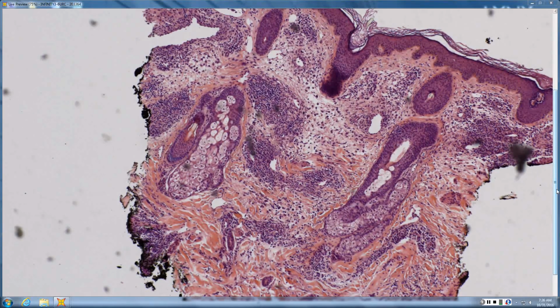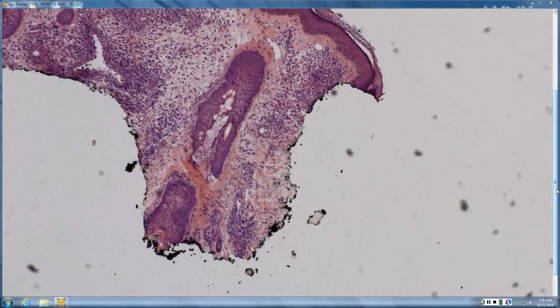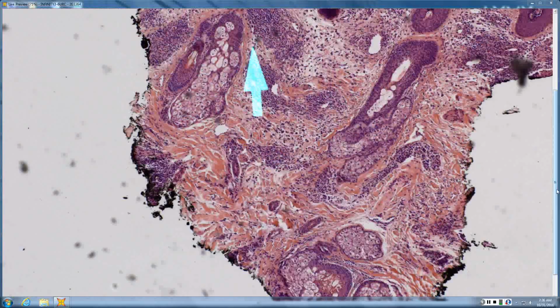Grenz just means border in German. So there's a little uninvolved border between it and everything around. That uninvolved border means it makes little boxes, little squares, little polygons of some sort separated from one another. And then if we saw neutrophils, karyorrhexis, and EOs at higher power, what would you think?